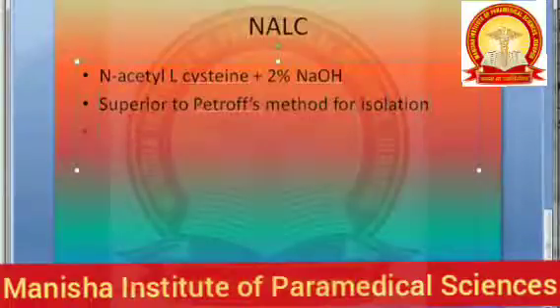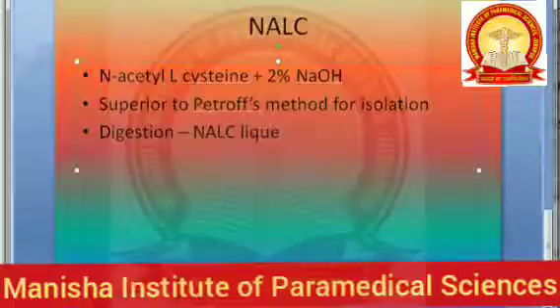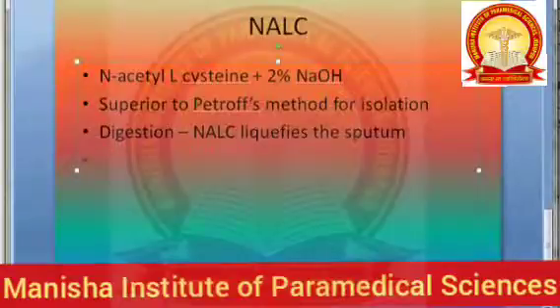Then NALC liquefies the sputum and NaOH kills the normal flora. So how do you digest? NALC liquefies the sputum. Are you awake, people? Because I am just telling and typing, I think you are sleeping, right? Wait.